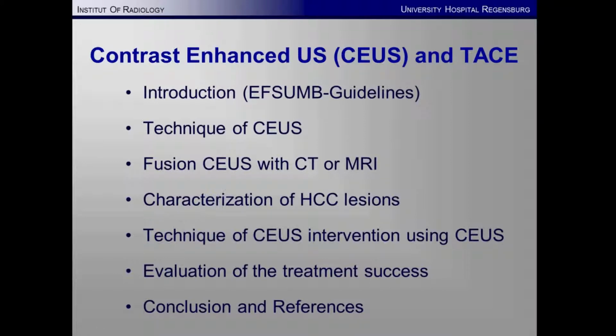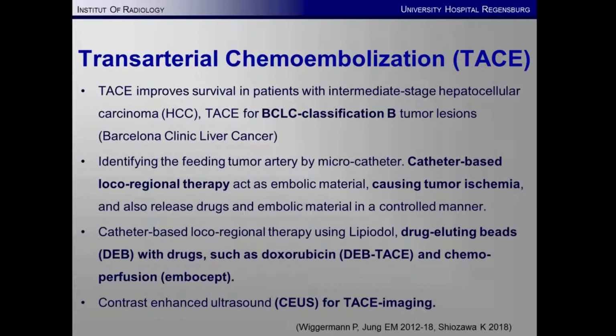What would be important? We have to talk a little bit about fusion for planning and for the follow-up. We have to talk about the technique of contrast-enhanced ultrasound, and we have to talk about a new kind of evaluation, the treatment success. First, what does chemoembolization, TACE, mean?